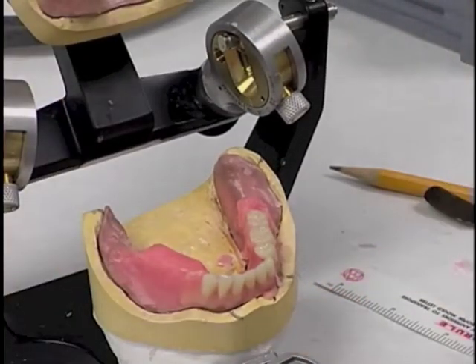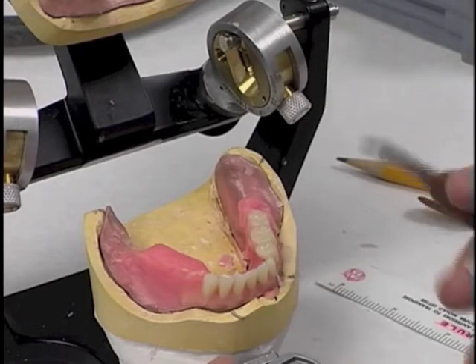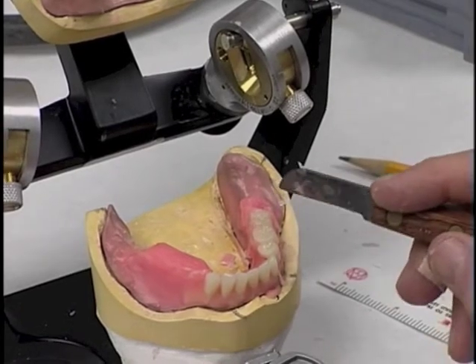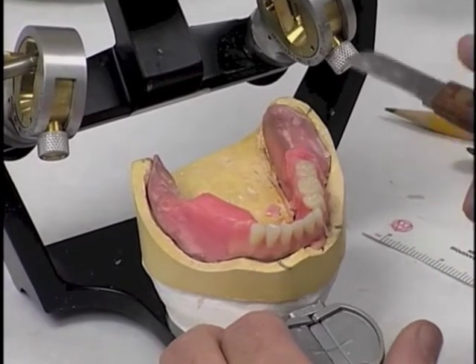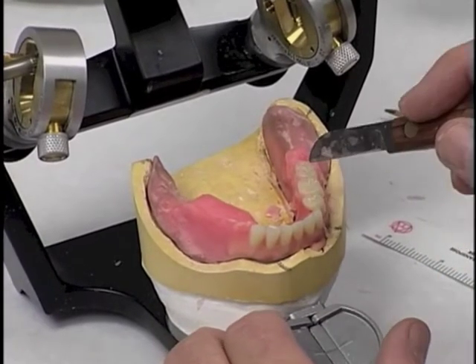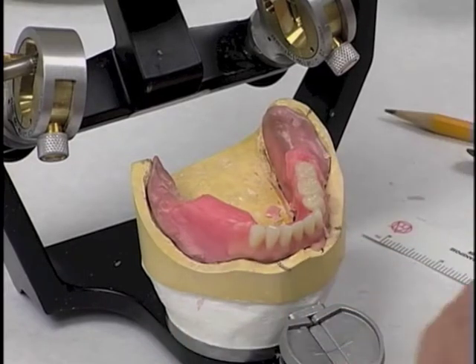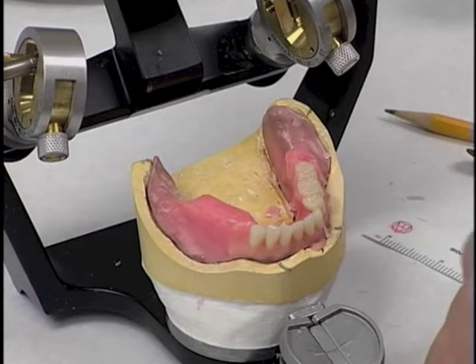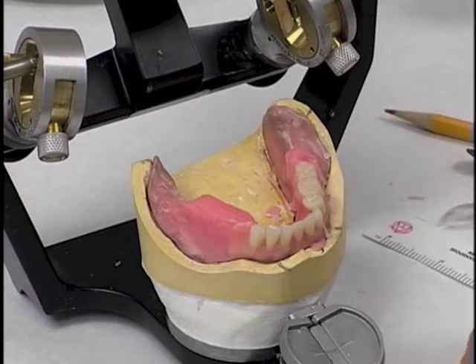The text tells us that if you need to, so to speak, cheat just a little bit on the position of those teeth, it's better to bring them slightly buccal than it is to take them too far lingual. And the reason for that is that if you take them too far lingual, it impinges upon the tongue space and the patient will have some difficulty with speech. I found, however, that in 99.9% of the cases that I do, if I keep them directly over the crest of the ridge, it works very well.